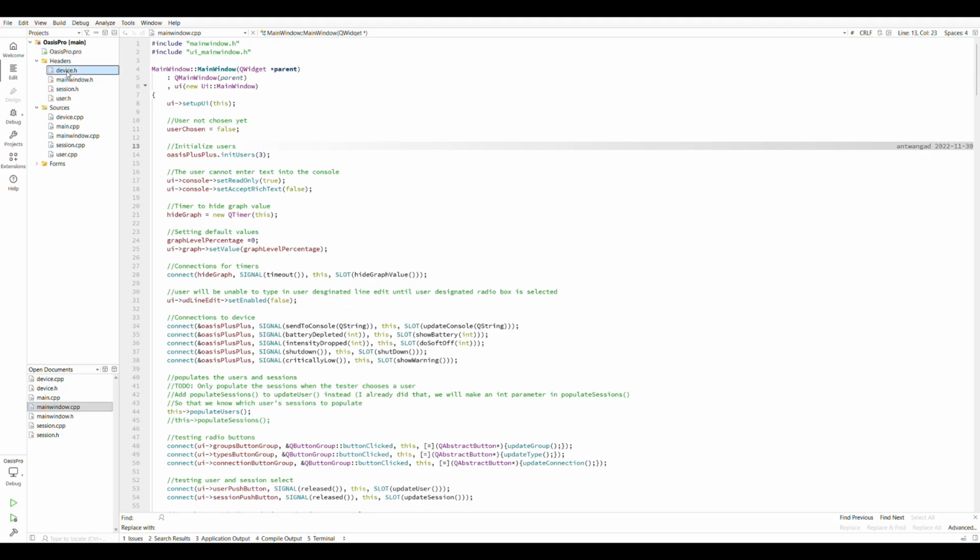I'll just give you a quick little overview of the code, at least the structure, so you can get an idea where to look if you're curious how something works. So the device, session, and user classes all work together to basically do the backend meat functionality of everything, where the main window class facilitates the connection between the GUI and the backend, as well as altering the GUI based off of the state of the backend.